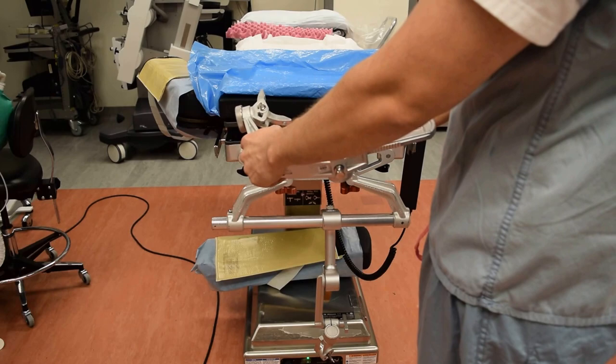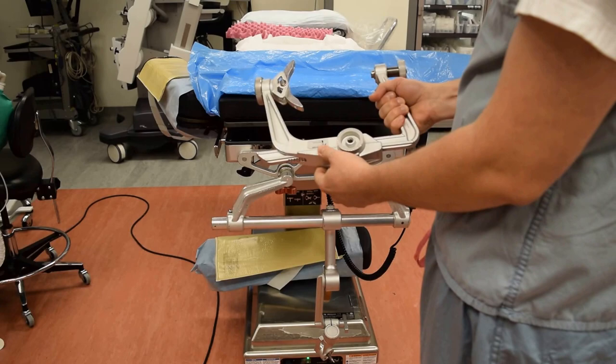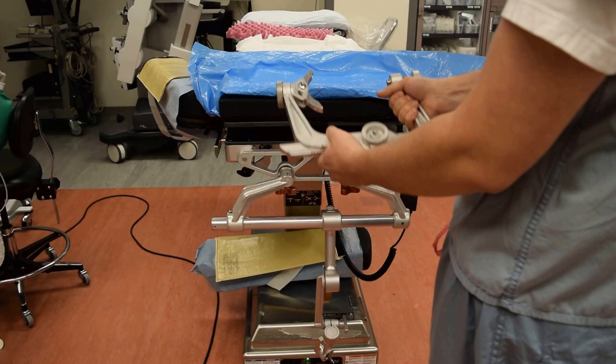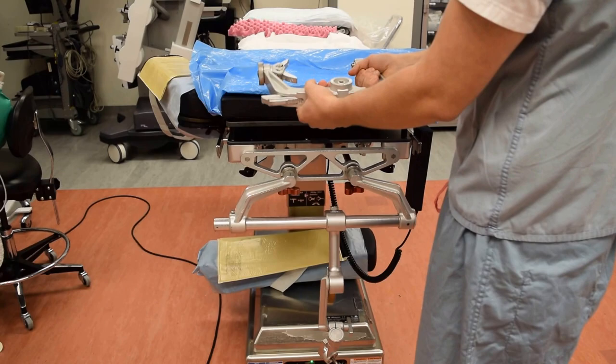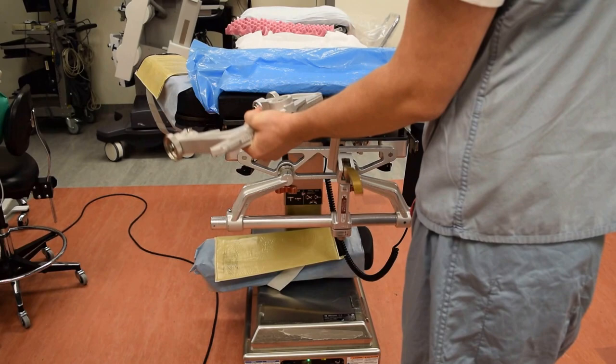Then we're going to find the correct position for the craniotomy and slowly place the Mayfield on the patient's cranium, then dial in the pressure. That's not the purpose of this video — it's simply to illustrate how this fits on the bed. So now we're going to imagine the resident is still holding the patient's head and they're pinned in place.